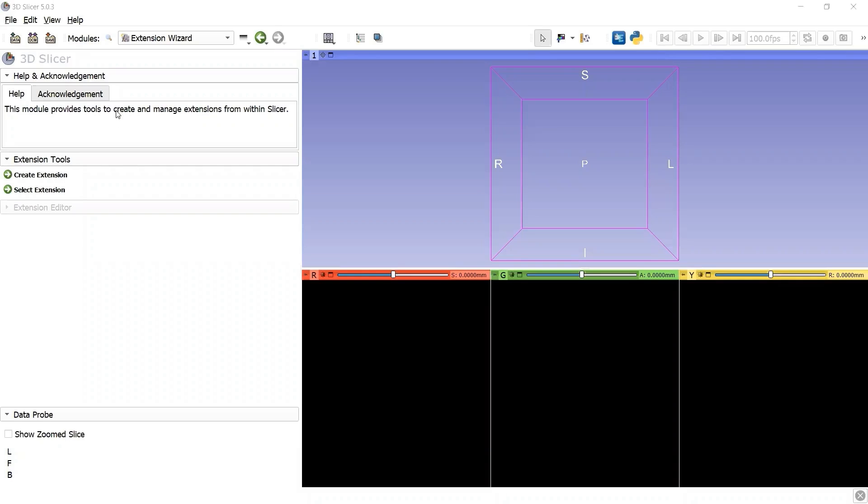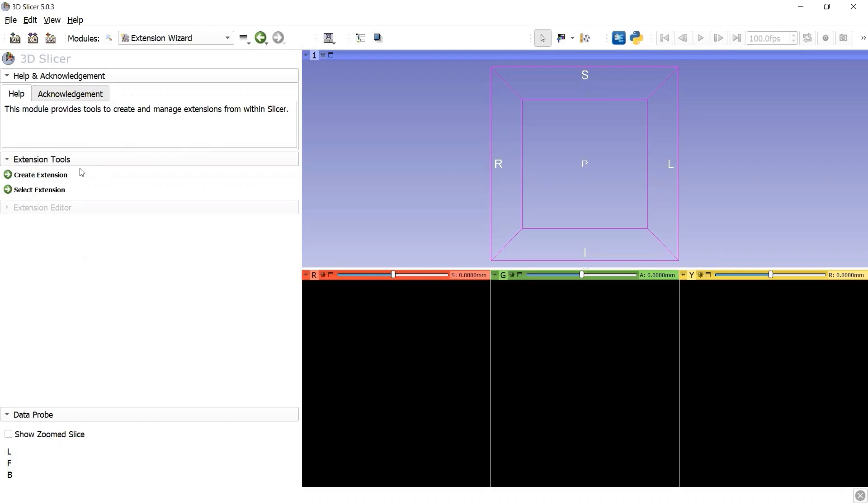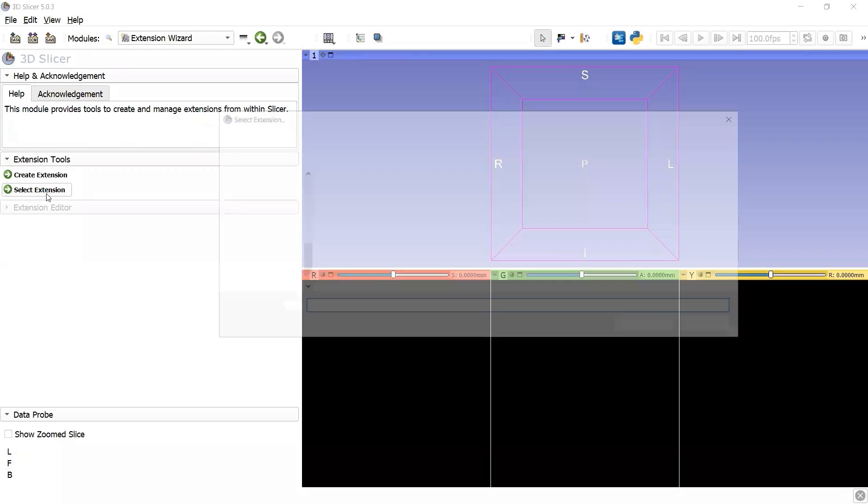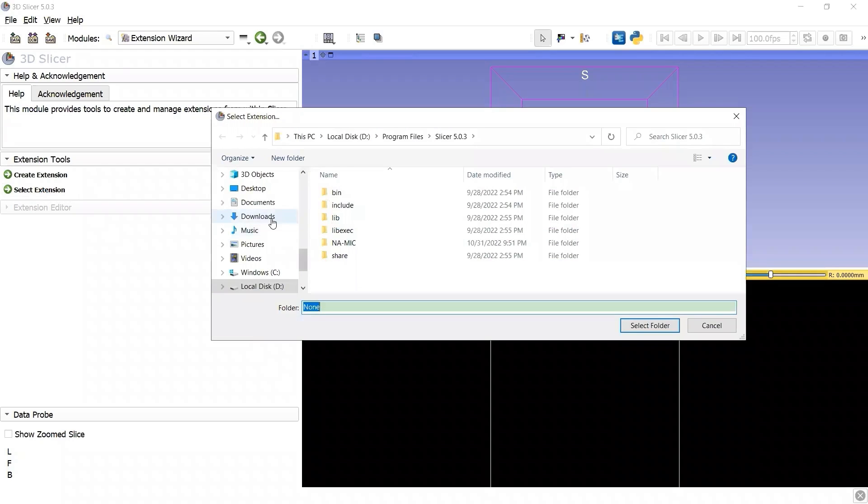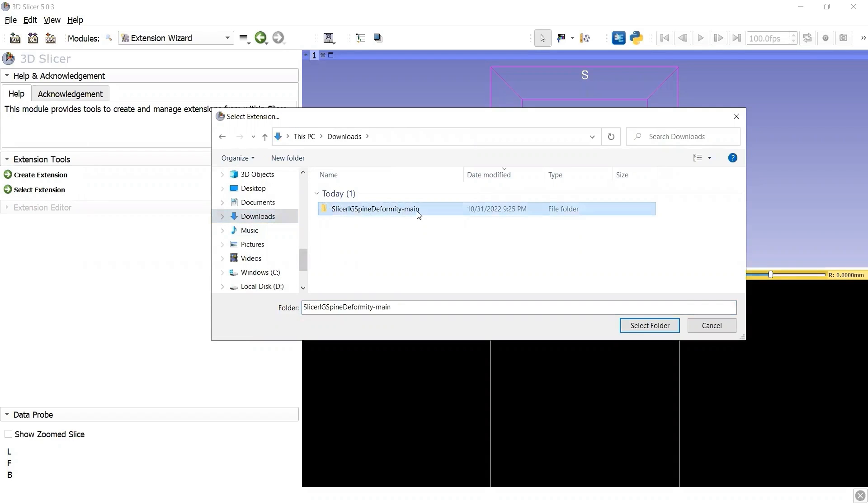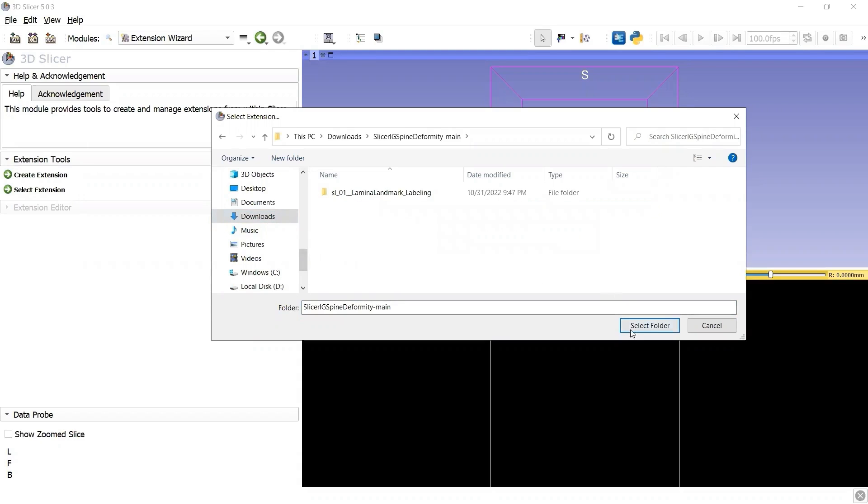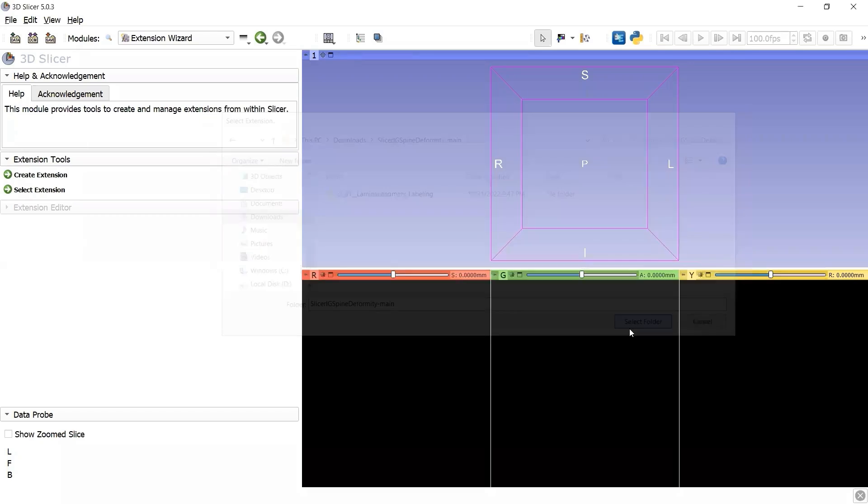This is where we can create and manage extensions from within Slicer. To install the custom extension SlicerIGSpineDeformity, click the button Select Extension, find the extension folder, go inside the extension folder, and click the button Select Folder.